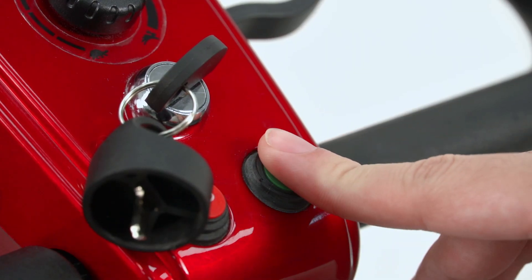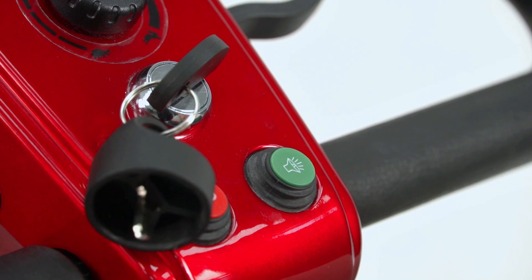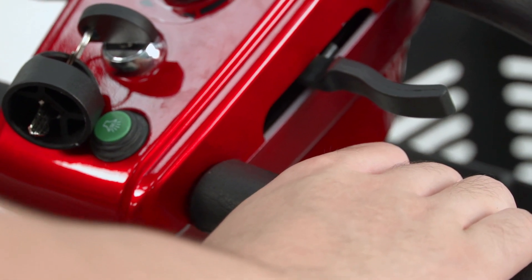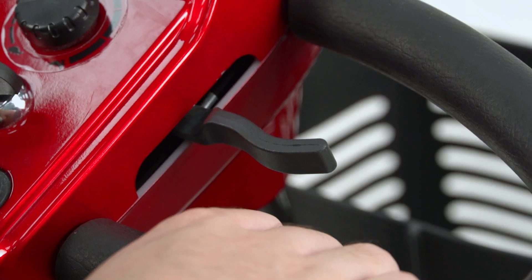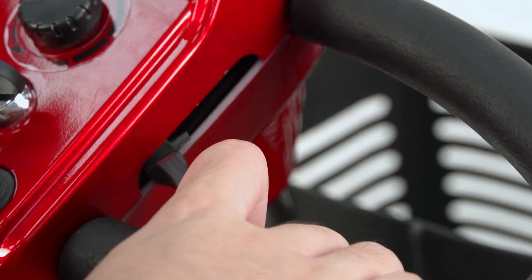Press the horn button if needed to alert other pedestrians and road users. Brakes: Once the lever has been released, the device will automatically stop. To move the device, just press down on either of the levers as shown before.